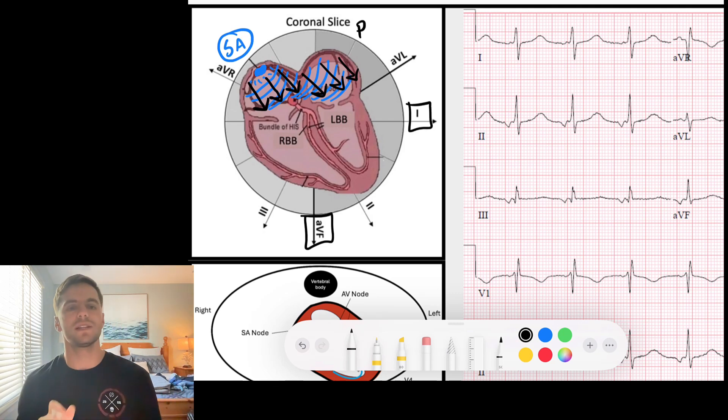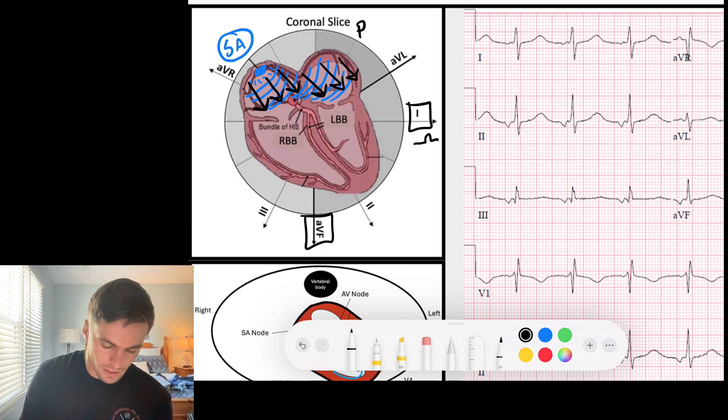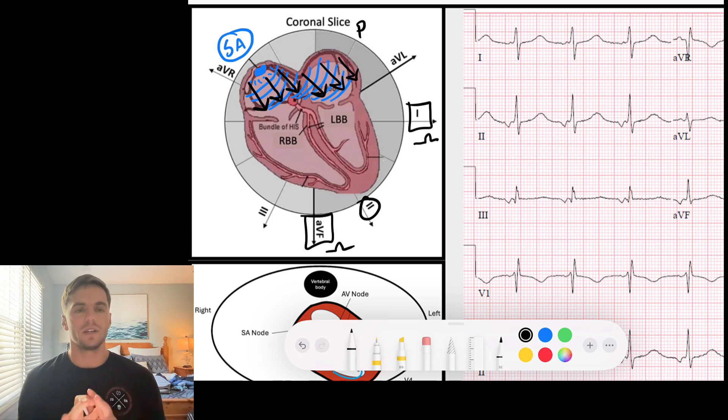And those P waves, if they're going down into the left, are going down towards AVF and left towards lead one. So we know that sinus P waves are upright in lead one and upright in AVF. Obviously they're going to be upright in lead two if that's the case, because it's also going down to the left.